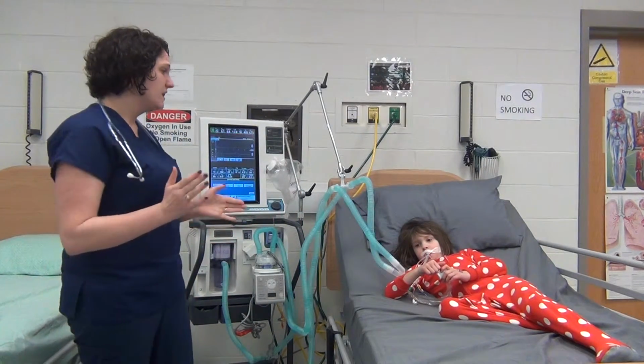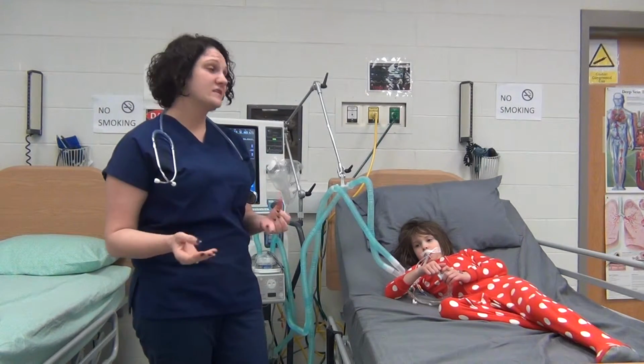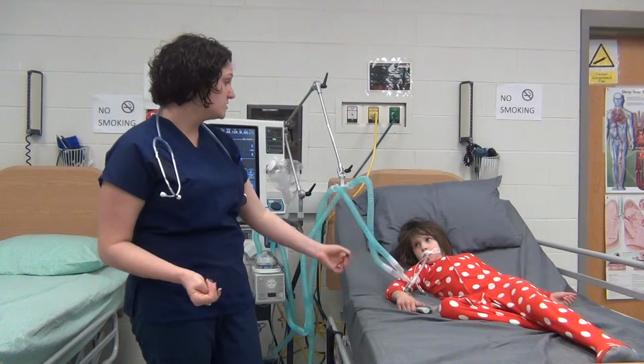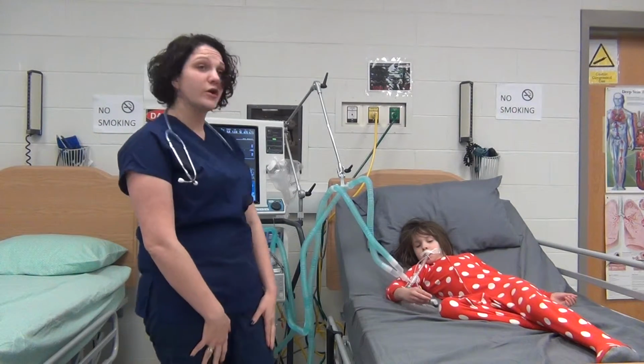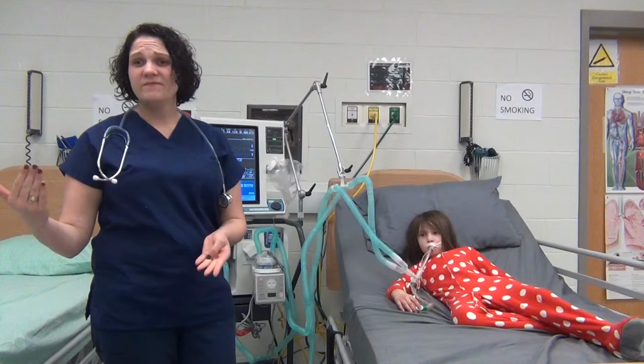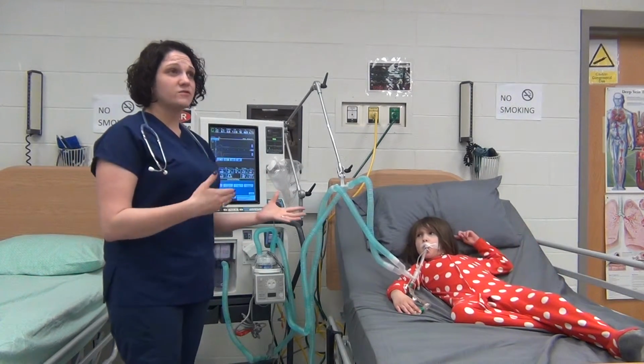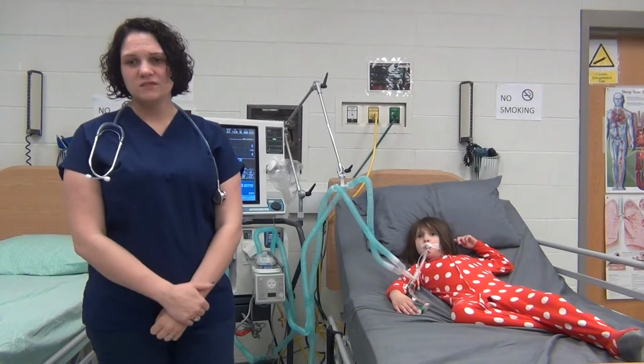And I would also want to assess her level of alertness, because right now, if I were to ask Mrs. Tubbs a question, she could shake her head yes or no. I wouldn't want to come in here after I did some vent changes and come to find out that she's unresponsive and lethargic. That would just not be good.